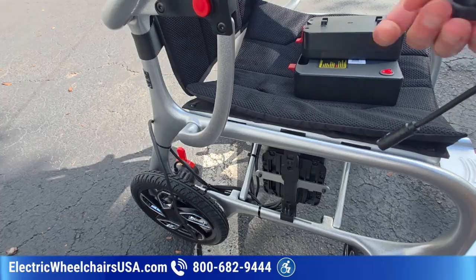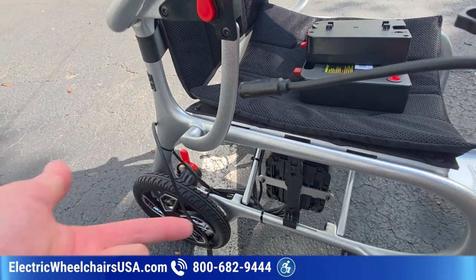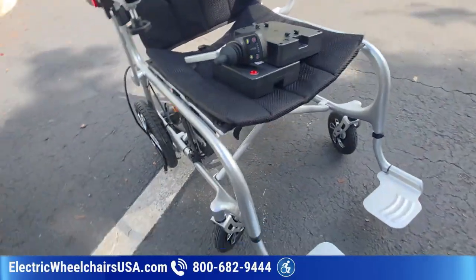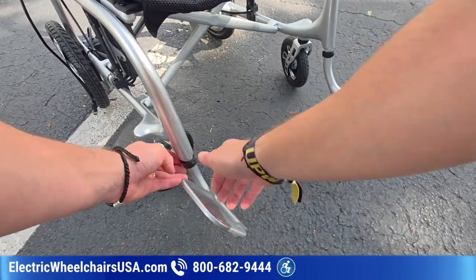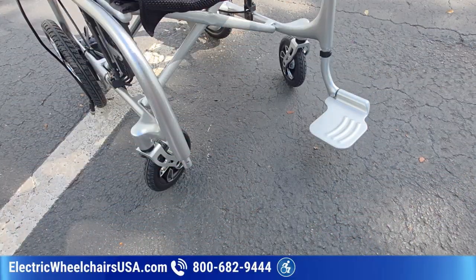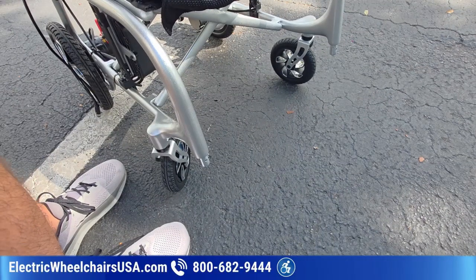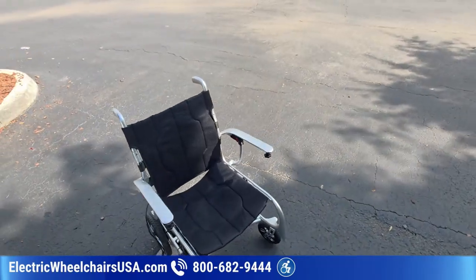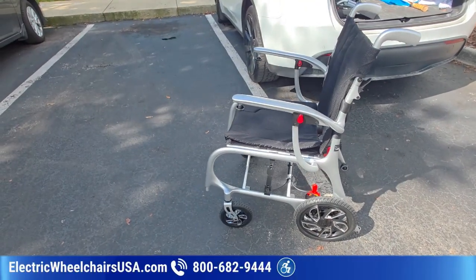I like this feature that you can take the joystick off just like this. Sometimes folding electric wheelchairs will have the wiring all connected, but you can just disconnect this portion, just take the joystick off. And then lastly, I would take off these footrests. So there's a clip here. You gotta pull this up, pull the clip out. Slides right out. Same on this side. So I'm going to put the joystick, 2 batteries, and the 2 footrests to the side. Now this is the most compact and most lightweight version of this by removing that stuff.